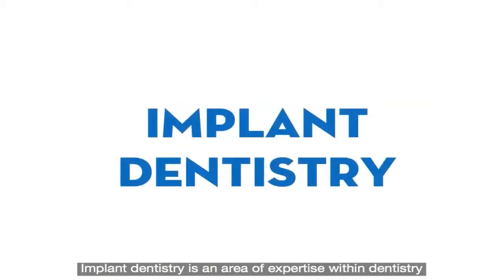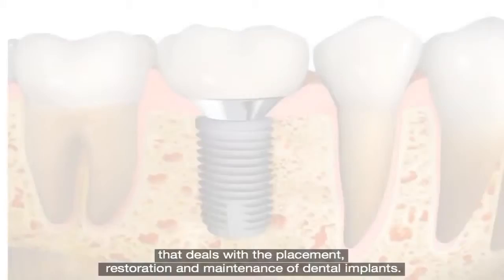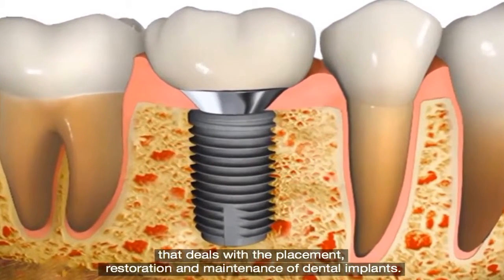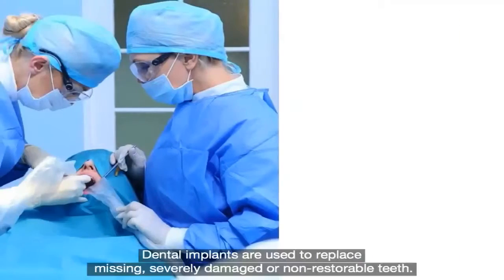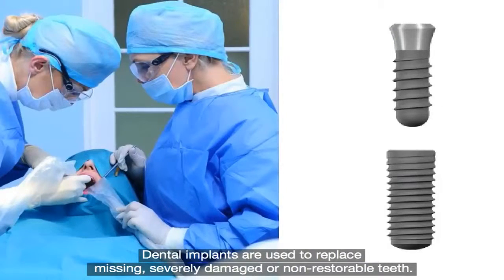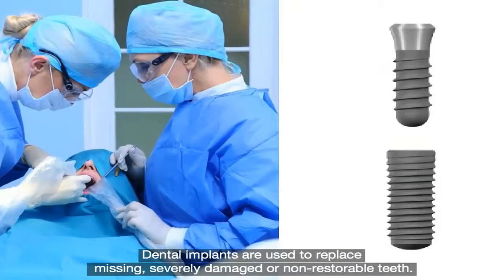Implant dentistry is an area of expertise within dentistry that deals with the placement, restoration and maintenance of dental implants. Dental implants are used to replace missing, severely damaged or non-restorable teeth.